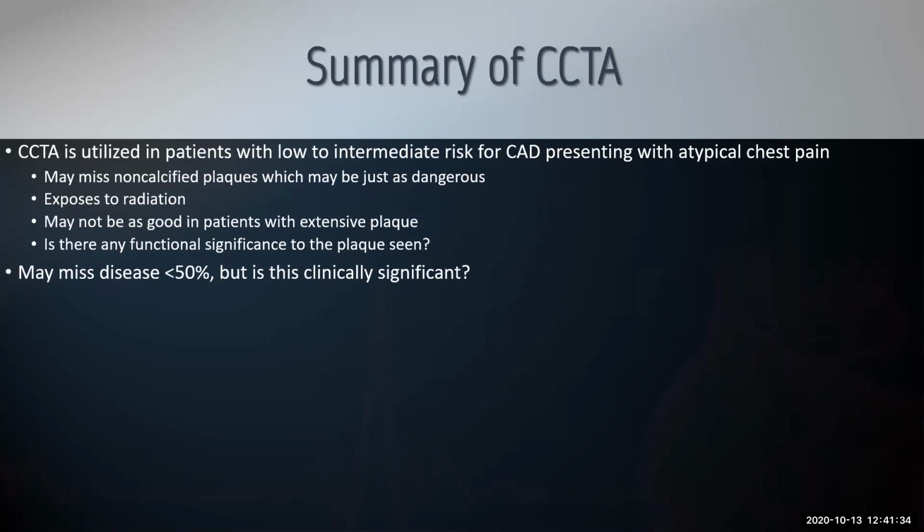Because they might have plaque, but they might have completely normal wall motion. So would you want to risk someone to have it, and Pat was talking about MRCP versus ERCP, absolutely too. It's very similar situations. So that's why the nuclear continues to be important, because we can see, is this plaque actually having any significant clinical effect to that patient?